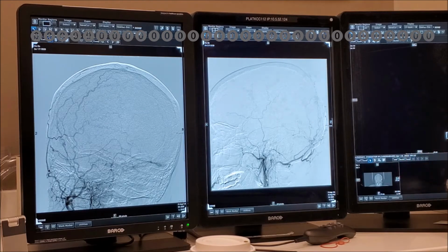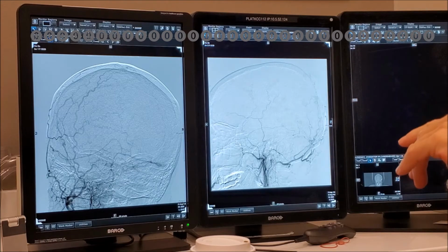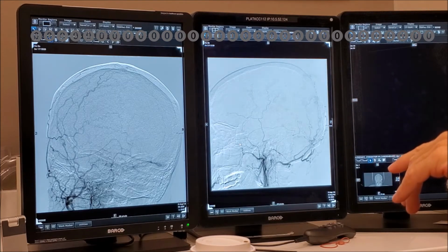Greg, stay with it. You're doing good. What is this one? Ascending pharyngeal. So we went through the anterior branch. What is important about this anterior branch? It goes to the palate, but what would be the anastomosis to this territory? How else can we come to this territory? Foramen rotundum. Warm, but from rotundum it's all the way here. Oh, Vidian maybe. Yes.